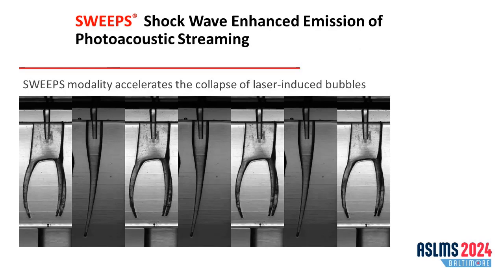The second bubble that starts developing exerts pressure on the collapsing bubble and speeds up the collapse, and we get shockwave formation, not just at the location of the bubble, but all the secondary bubbles also collapse and generate shock waves. This is important because this is how we get effects deep within the cavity, deep in the root canal or deep in the periodontal pocket.